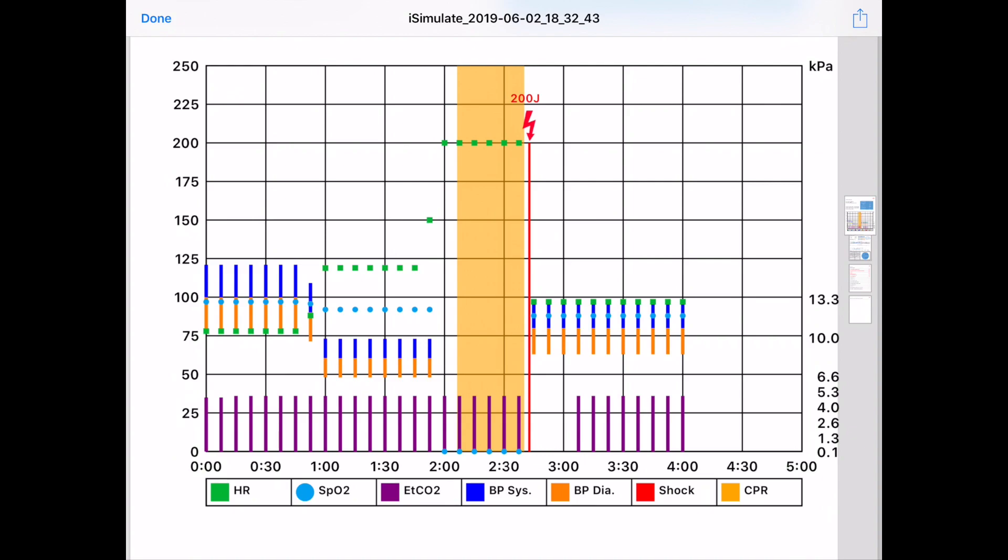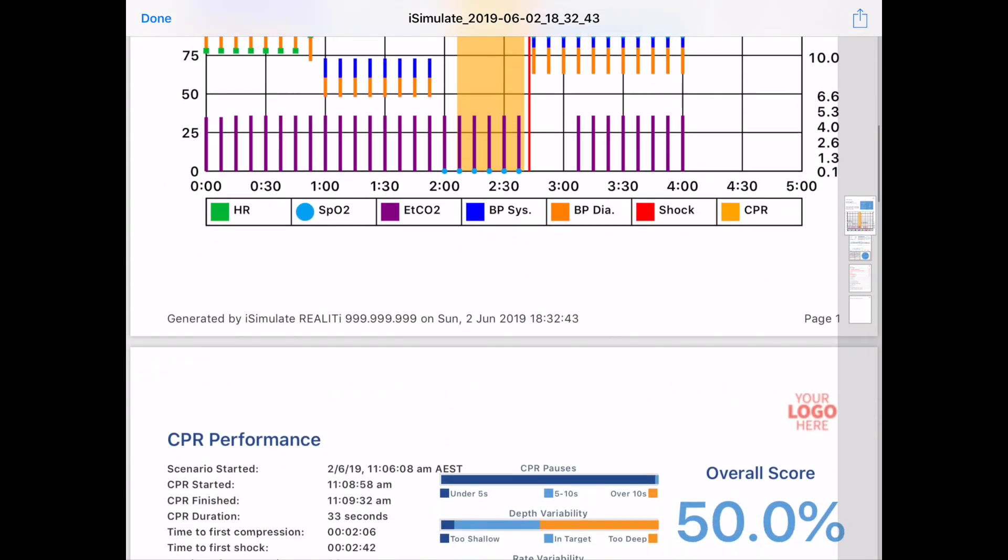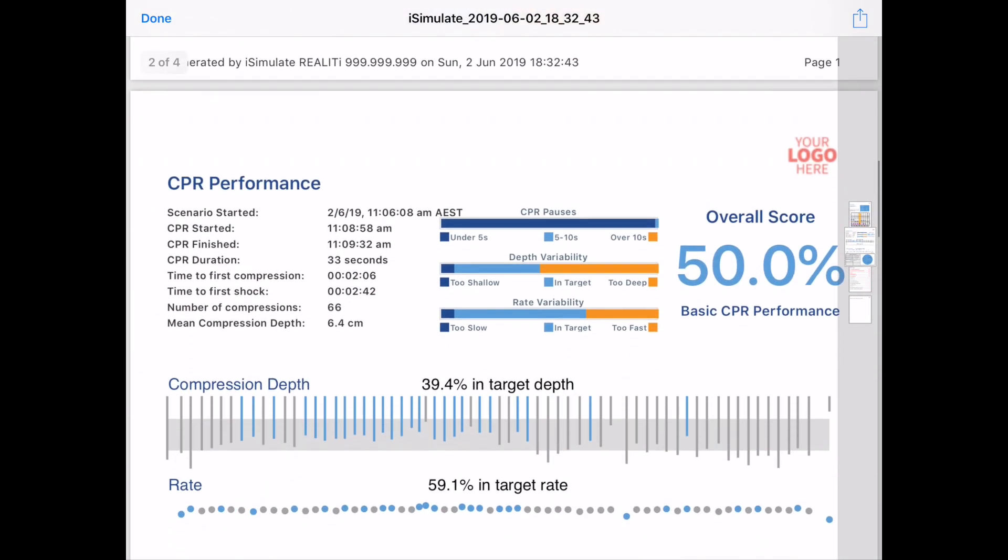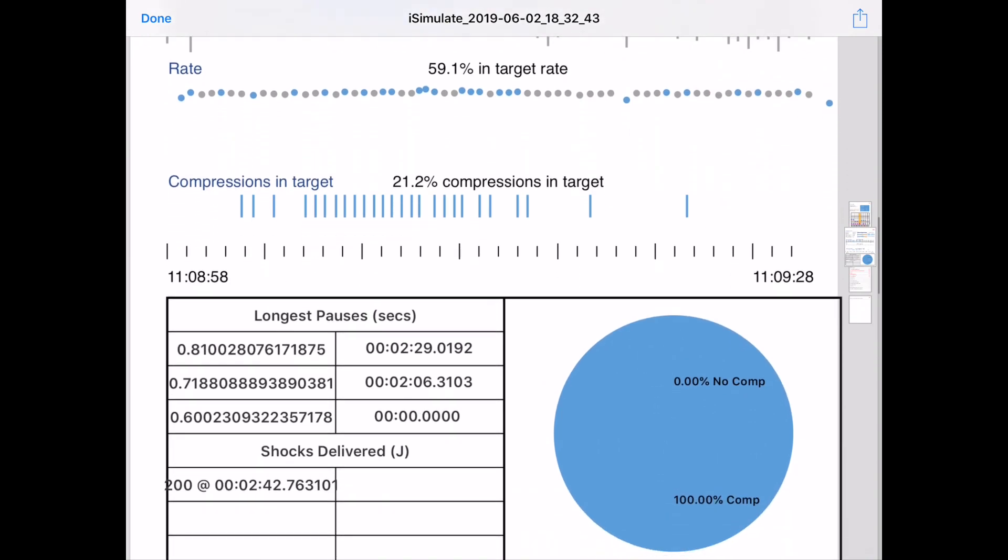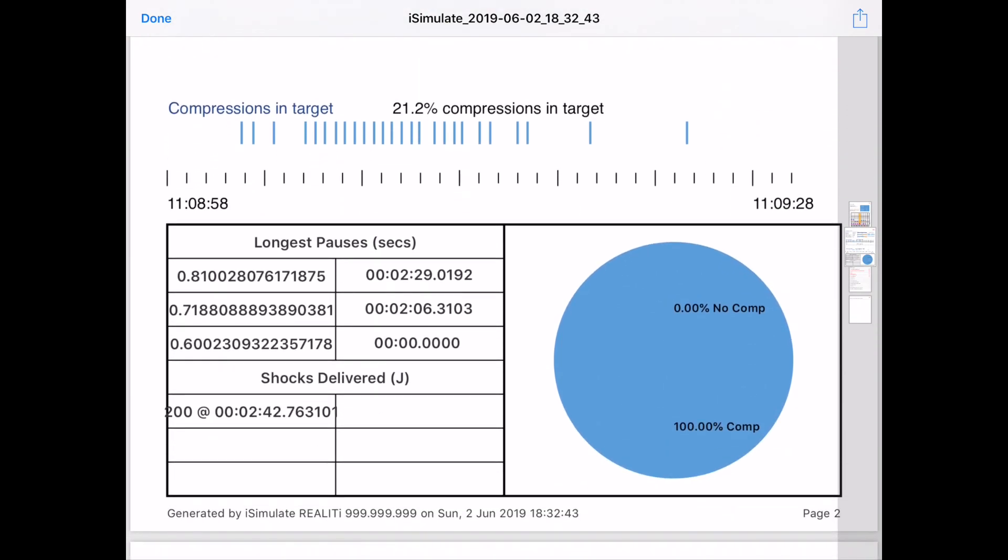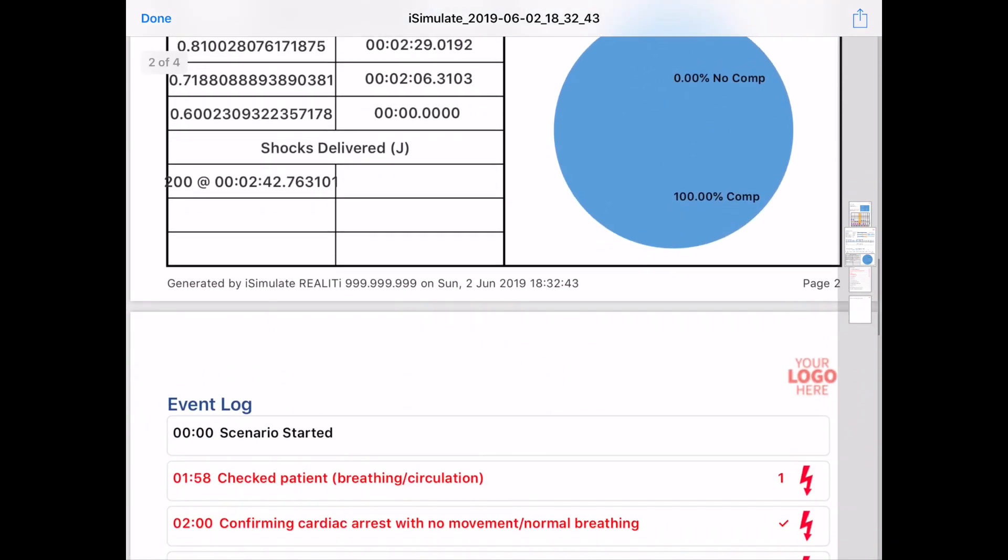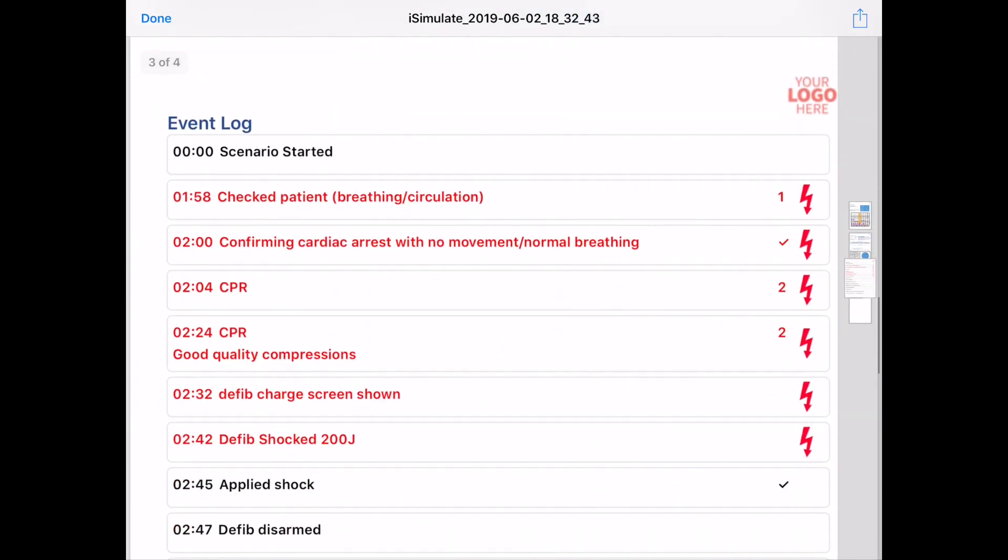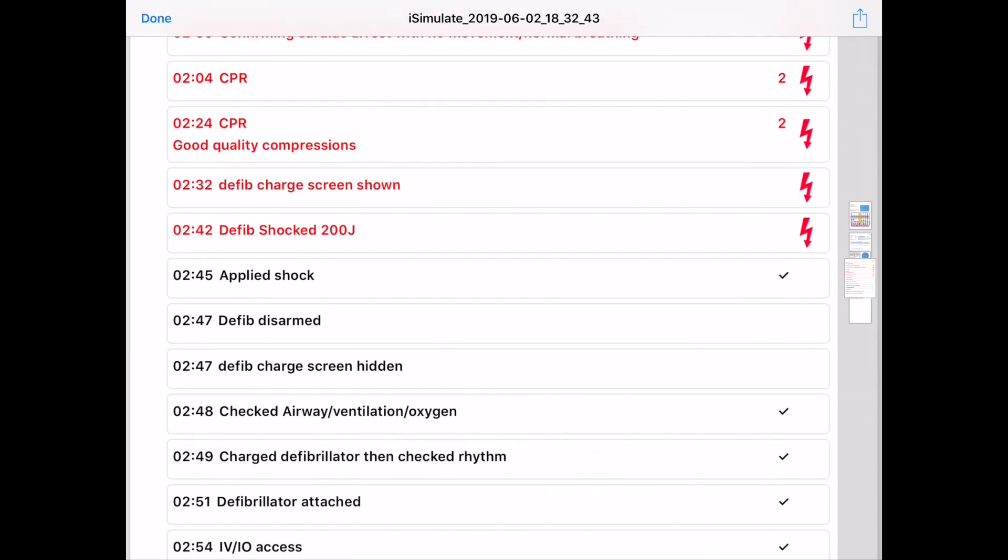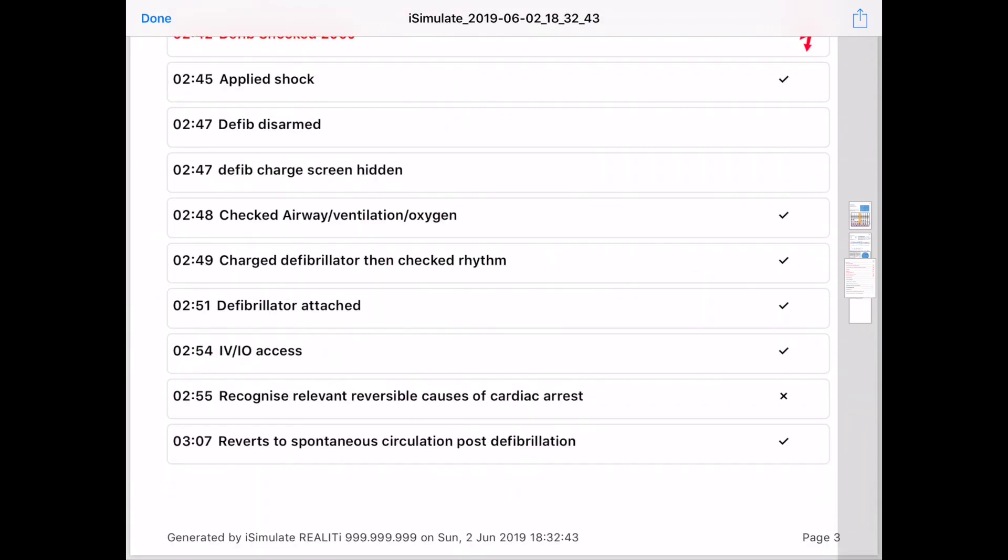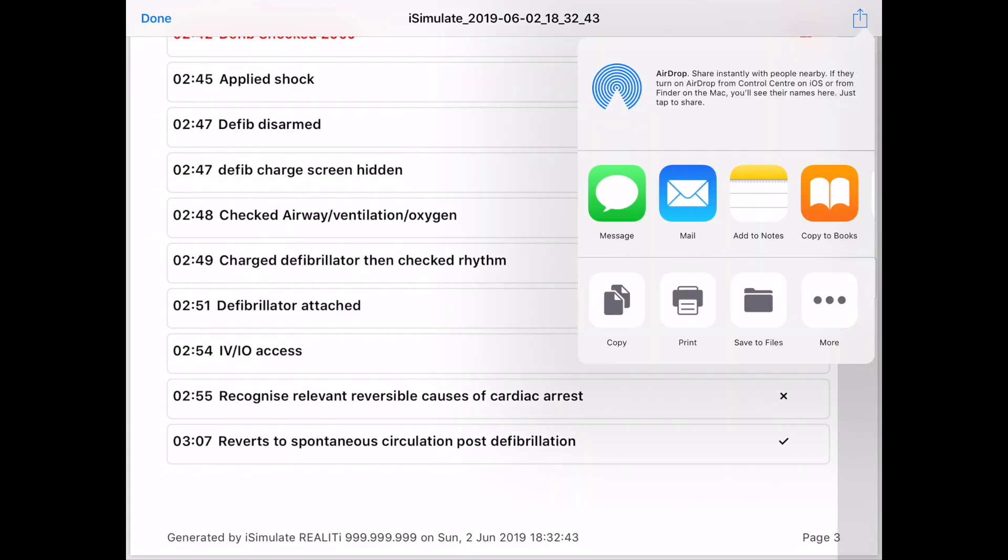You could also print this out on a black and white printer and still be able to identify each of those parameters. The next page of the PDF is the summary of the CPR performance. And then the following pages are all of the event logs as well. And I can share this by pressing on the share icon at the top. And that shows me how I can airdrop, message, mail, and so on.